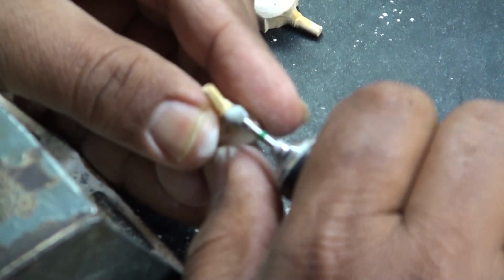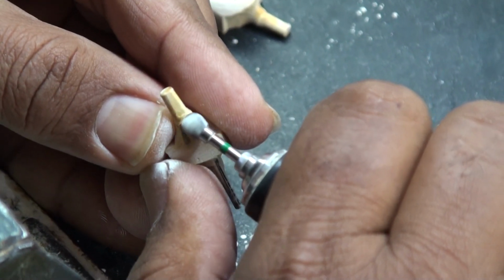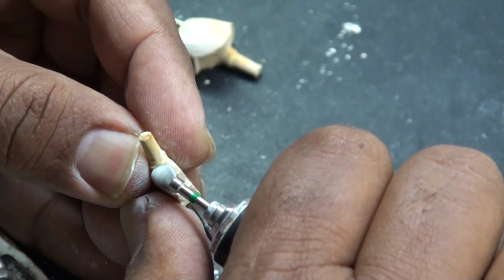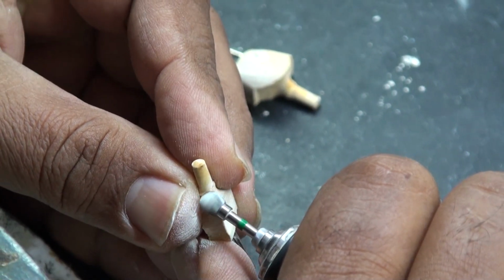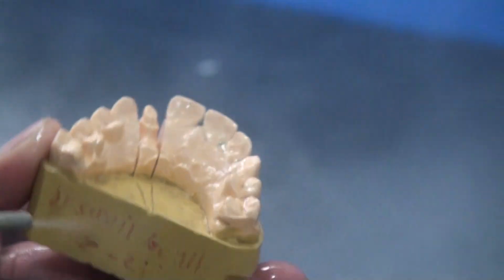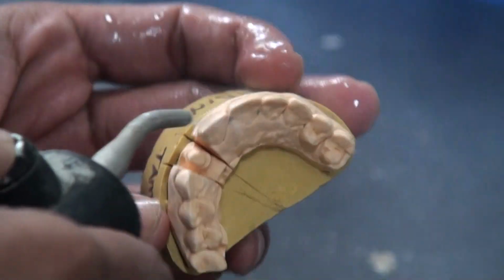Now I'm trying to focus here, and as you can see, my camera doesn't focus very well at a close distance, so I have to zoom out a little bit. There we go, and you can see he's using a little round burr on the straight handpiece and trying to ditch. So he's trying to basically define the finishing line of that prep. You can see how careful he has to be. He can't trim any part of the prep at all. So that's all done, and then the model is getting cleaned.